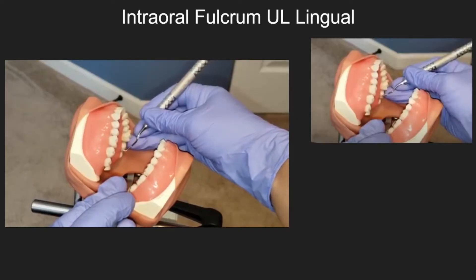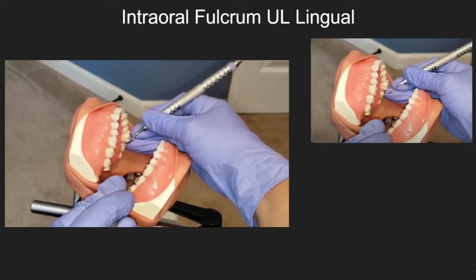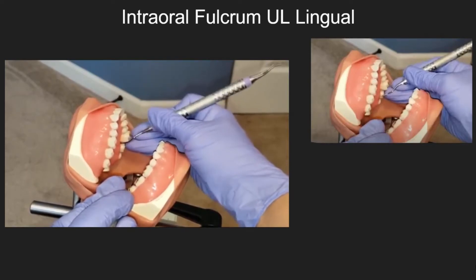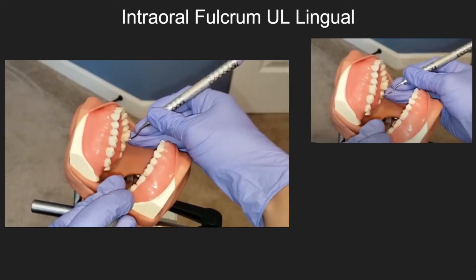Intraoral fulcrum — upper left lingual. Notice how the hand is maintained as one unit as the clinician rocks on the fulcrum.